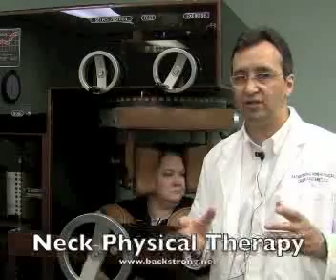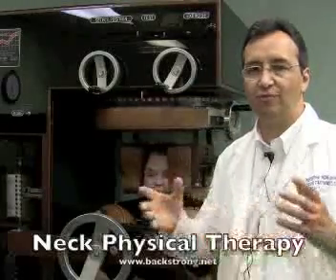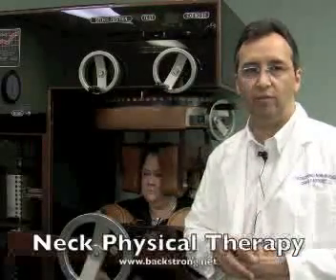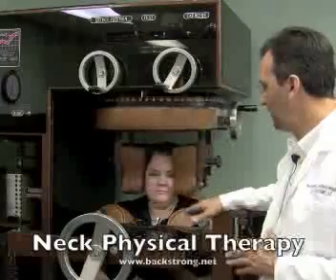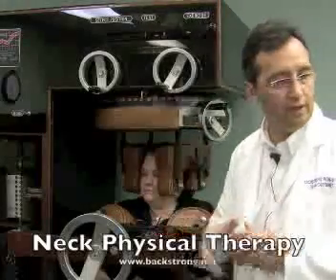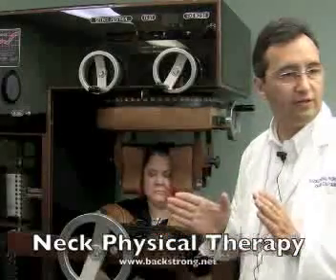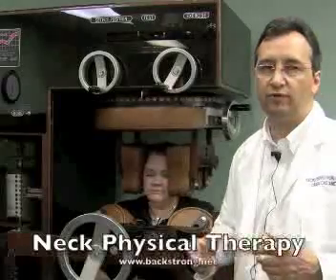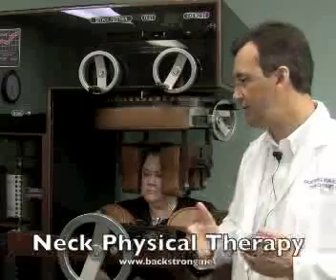Even for degenerative conditions, often people are stiff, and this helps with that, sometimes dramatically. But it's a good thing to try for anybody with a neck problem for whom it's not contraindicated. Anyway, what we have here is Marianne secured to the machine. We set it up so that she works through the range of motion that is comfortable for her. Oftentimes it's limited after an injury to a much lesser range of motion, but that generally improves as you rehabilitate the tissues, so that over time patients will move further and further in each direction.